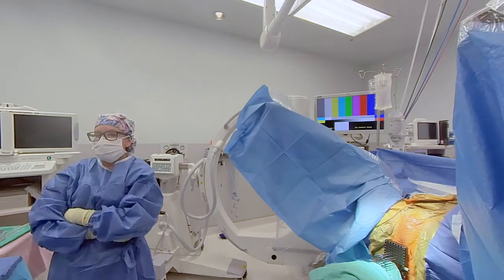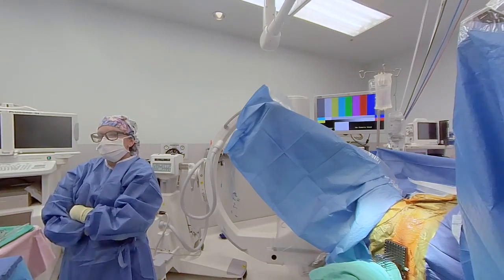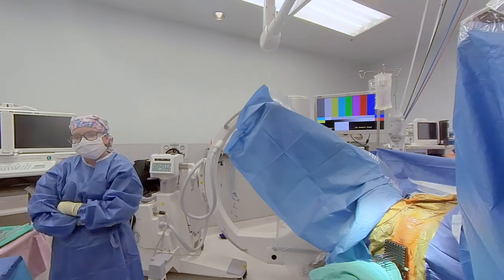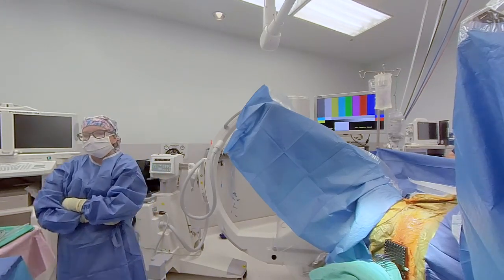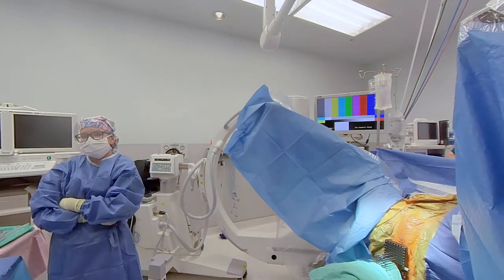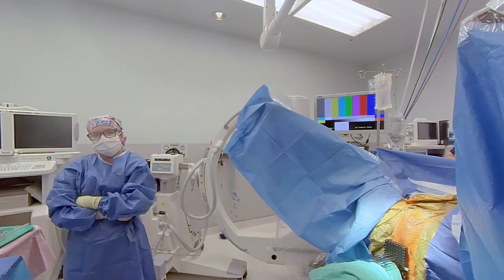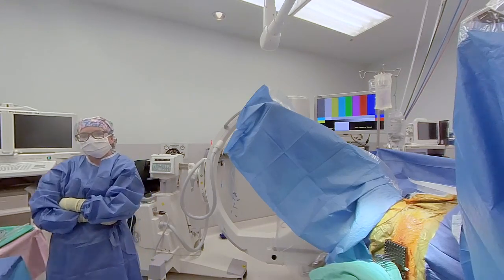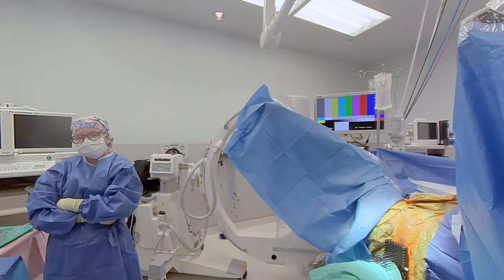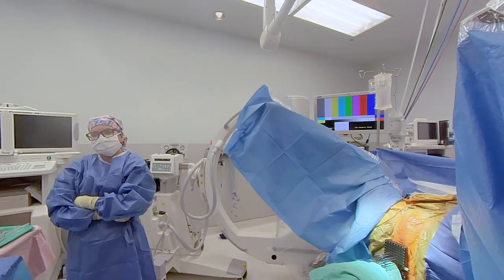Okay, and the total number of seeds available for implant? 89. Okay. Again, making sure that when we do the planning, only the live current needles that we placed are being used for this plan. If you turn this off and run a plan, it will add some more needles. So you can allow the computer to do a complete optimization, but by manually placing the needles ahead, it forces it to stay within the constraints that you've given it. And this is primarily a modified peripheral loading, but it's inverse planning.